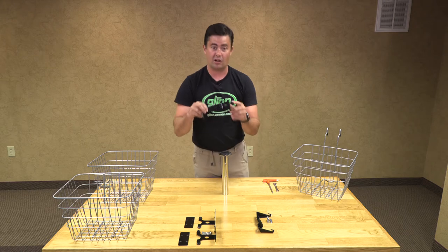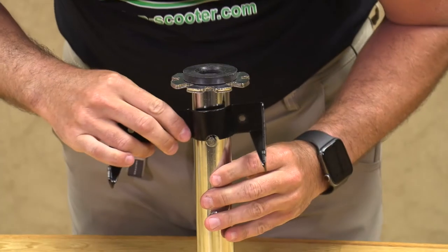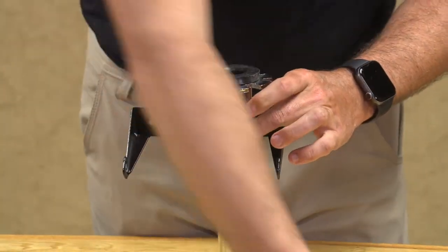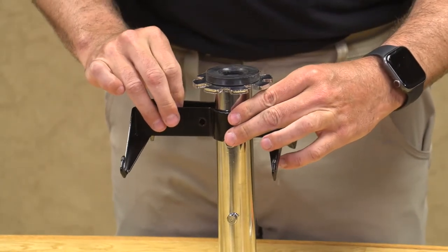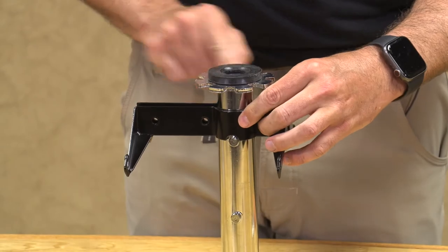We are going to take our basket assembly hook. You see there is a little notch right here — that notch sits right above that peg. Then we are going to line up our other one on the back side, on the opposite side, so that our bolt holes line up.